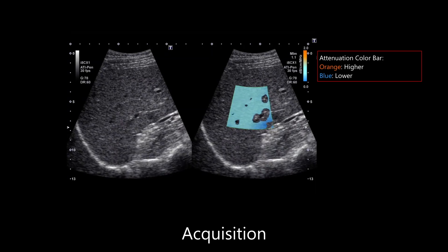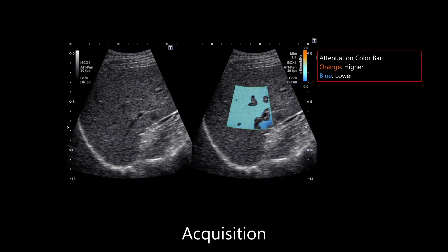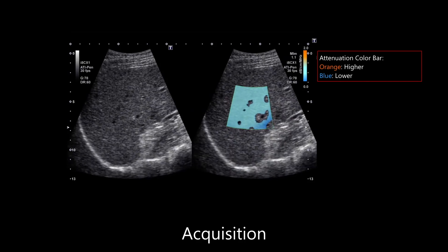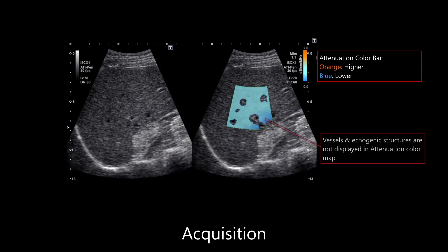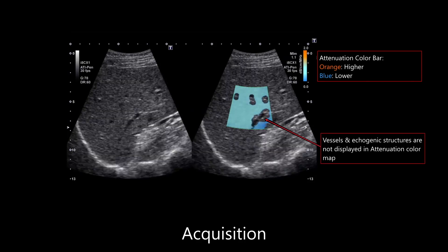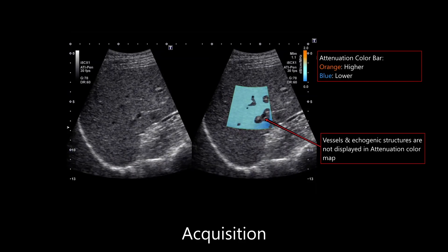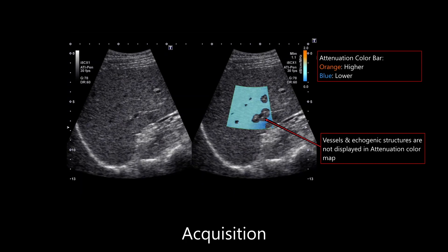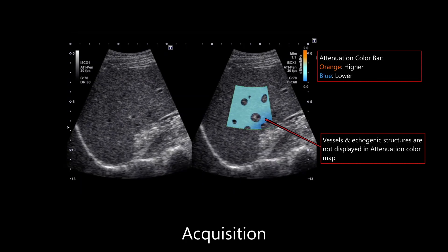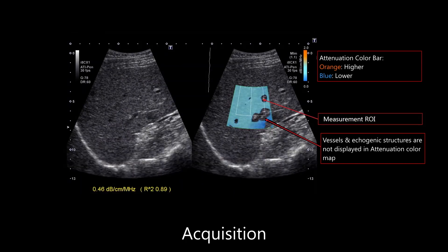The real-time attenuation color map can be displayed side-by-side with the corresponding grayscale image. Large vessels and echogenic structures are automatically excluded from the imaging ROI, making it easy to assess attenuation from the liver parenchyma. Once the image is frozen, the measurement ROI automatically appears and can be pre-sized for fast operation. After ROI placement, a single button press completes the acquisition.